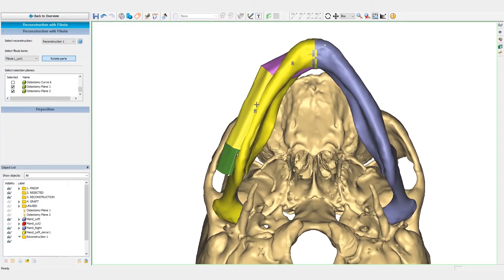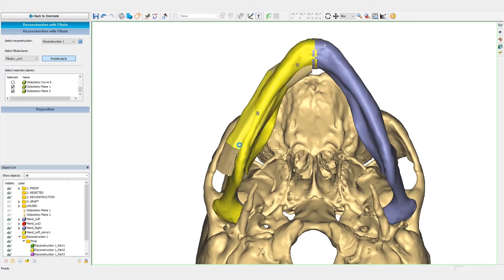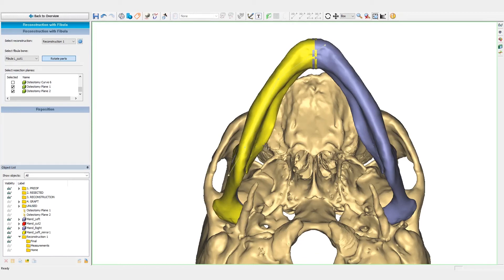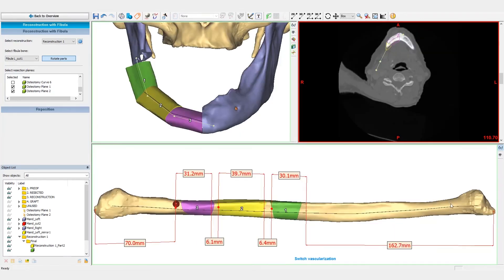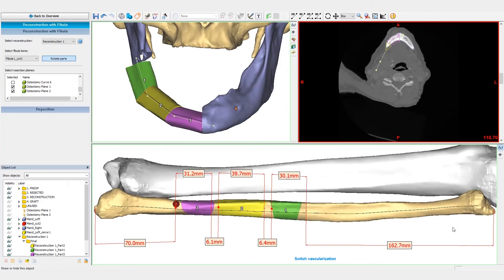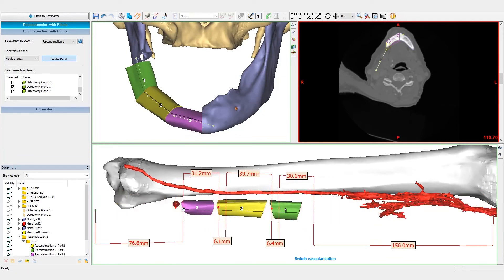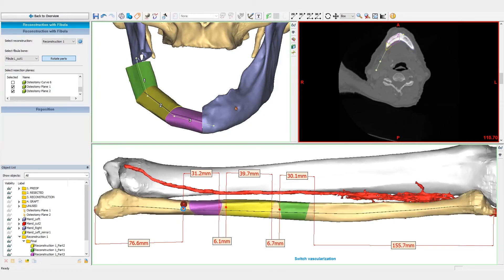We will now fine-tune the position of the Fibula segments in the mandible. This is done by changing the segment's orientation and the direction of the osteotomies if needed. We can either work directly on the mandible to change the angles and the length of the segments to make sure that there is no overhang, for instance.